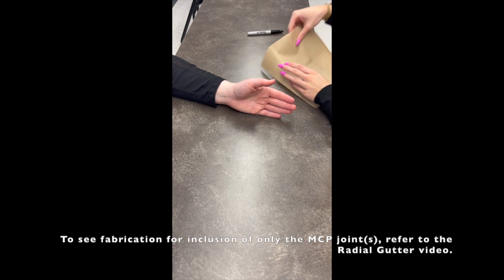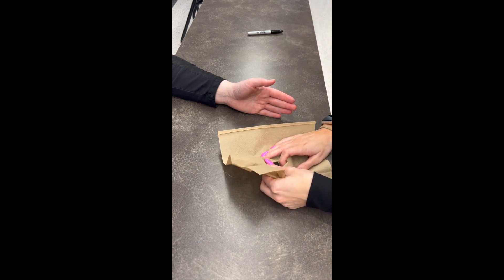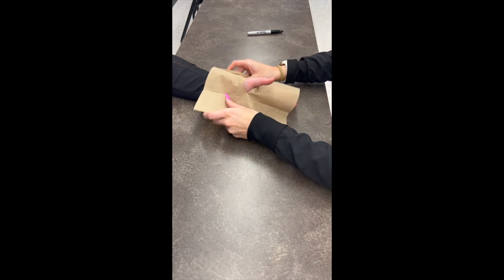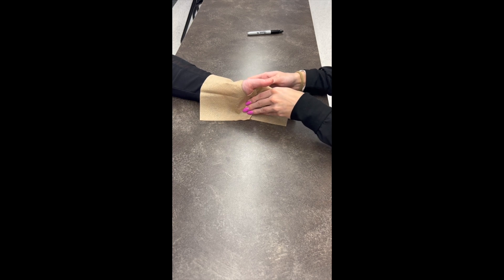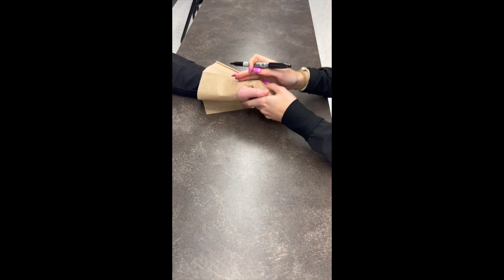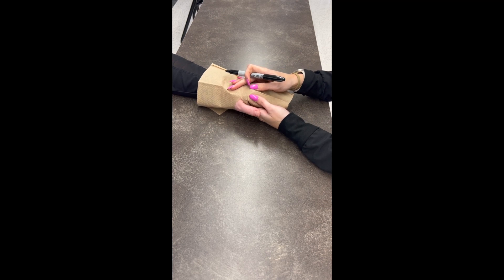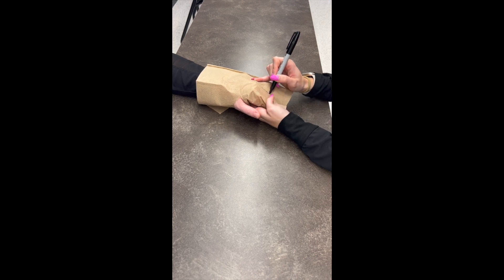First we'll start out with the pattern. We're going to poke a thumb hole over the thumb, and then position the patient in intrinsic plus position. This is full extension of the IP joints and flexion of the MP joints. On the dorsal of the hand, palpate the metacarpals. Since we're including the index and middle finger, we're going to mark after the middle finger and extend it out.